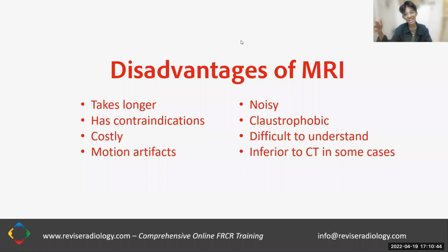And for the radiologist and other people who interact with the images, it can be quite hard to understand the concepts involved in MRI, because we're now dealing with very complex phenomena, which are particles. So we have to bring in concepts from quantum mechanics, from electromagnetism, and all of that is quite difficult for the radiologist to have a working knowledge.